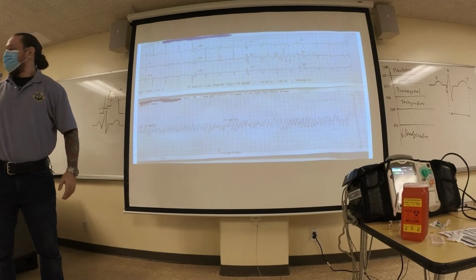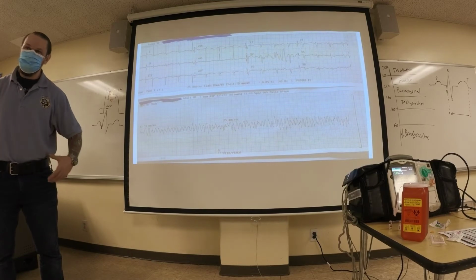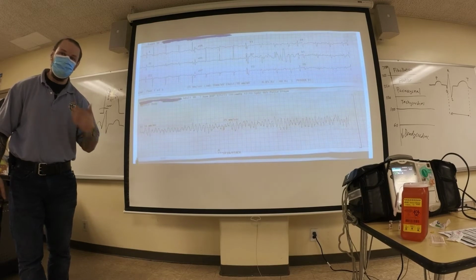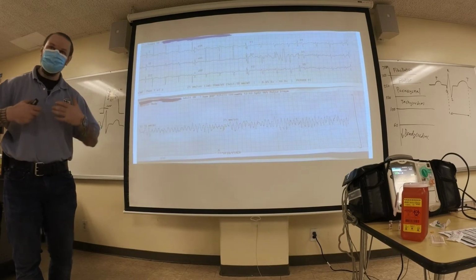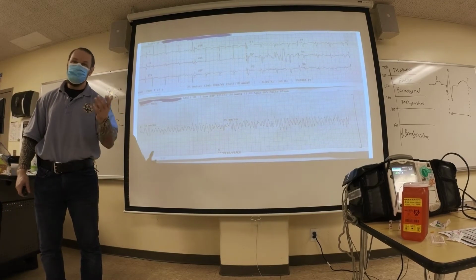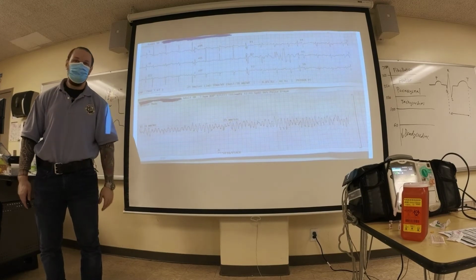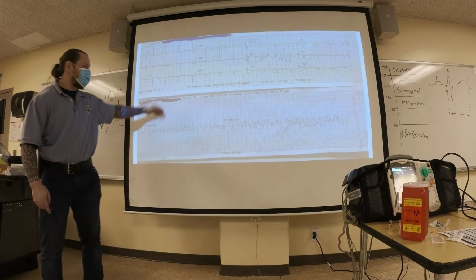You put it on the wrong guy? No, you check if he has a belt, he probably has an LVAD. LVAD is a device that when they have heart failure, they place it, it's like a pumping turbine. So check if they have a belt with batteries. Look at his chest, if he has something hanging off of it and a belt with batteries, he probably has an LVAD. Those guys may have VFib, V-Tach, and they'll talk to you. But other than that, there's no pulse with VFib. So if you see this, do the 12 lead, right?